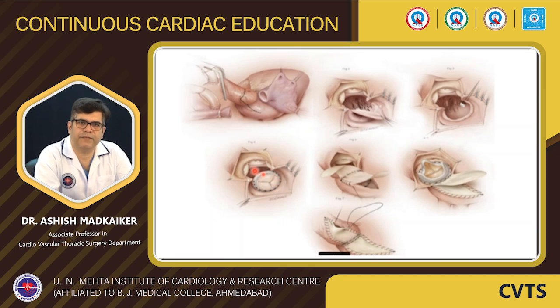Now to close this defect, we take a pericardial or a Dacron patch, fold it onto itself, and then pass stitches from outside in to complete this defect. So this defect is completed with a folded patch here, and the one half of the patch is used to close the LA, and then from this end we will take the remainder of aortic stitches, and the rest of the aortic stitches will be taken on the annulus, and the remainder of the stitches will be taken through the patch, and the valve will be seated in this particular position, and this patch will be used to close the aorta.